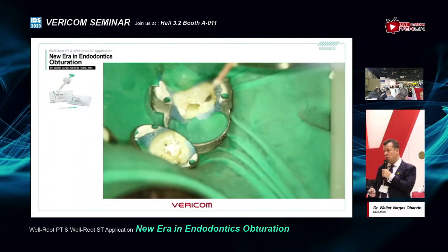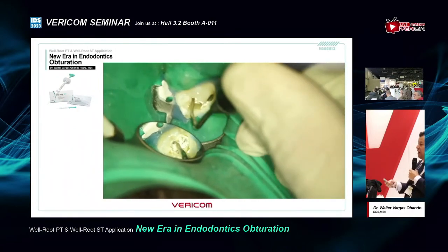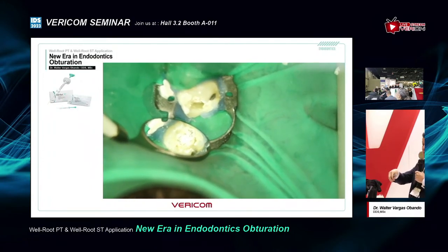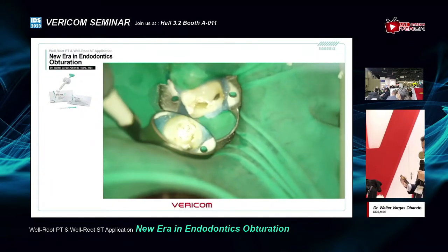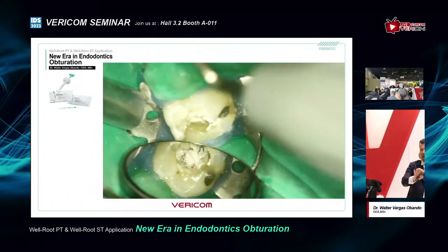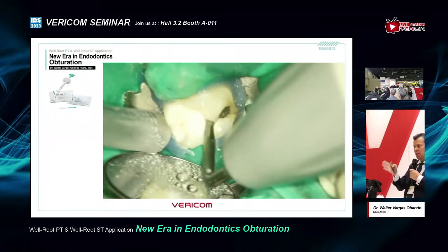And the other thing that I want to show you, I don't know if you remember, but if you are using the epoxy resin cements, it's really hard to remove from the pulp chamber. You have to use alcohol or something harder to go forward to do the resin or the closure of your core. Okay? Remember, right now, we are not leaving a cotton pellet or something like that. We finish the root canal treatment and we go forward to seal the pulp chamber.